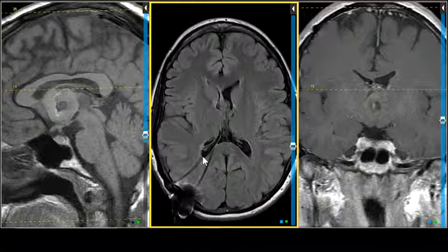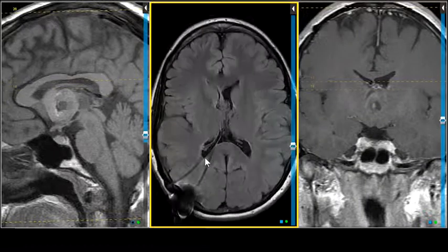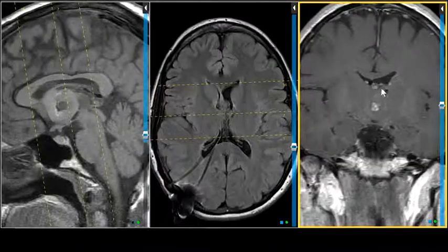So we got shunt apparatus here. And in fact, you got two shunt tubes. So why are there two shunt tubes? Well, they're working. Two is better than one. Well, no. If it was working, there'd only be one. Okay. So all right. That's not a good sign. You got one that's kind of over in the thalamus, and so the tip is there.